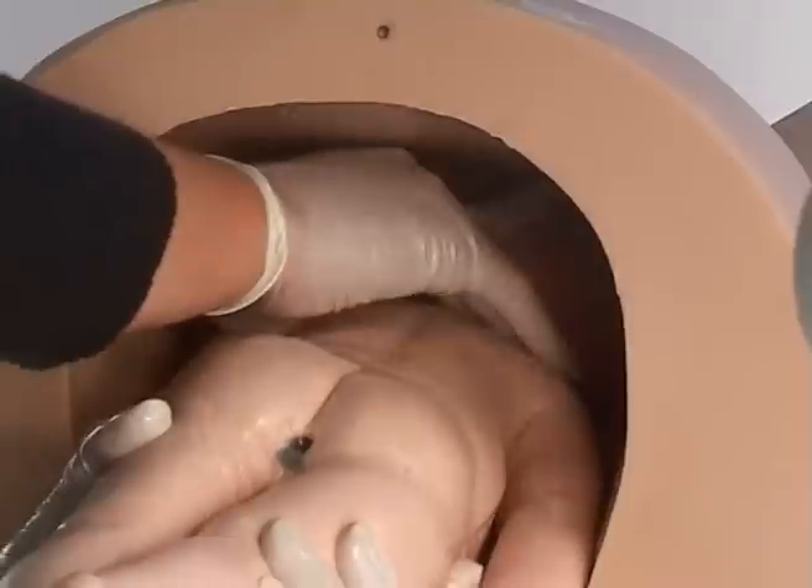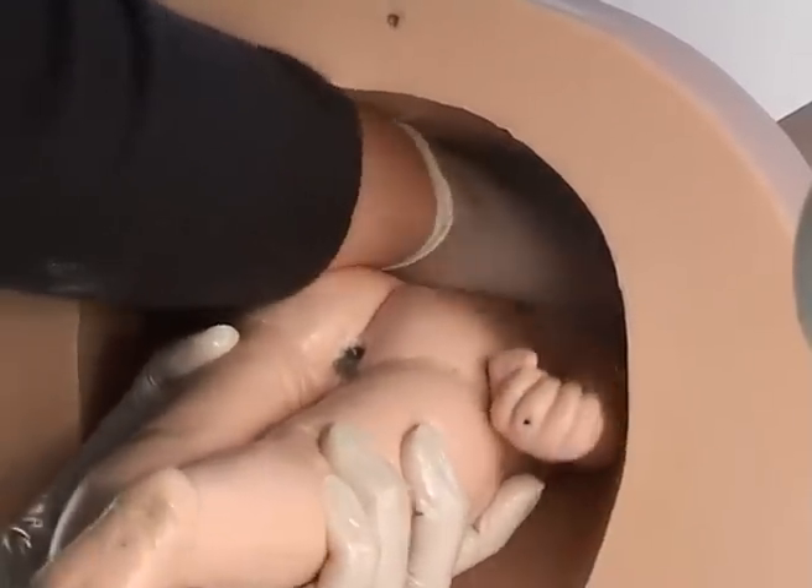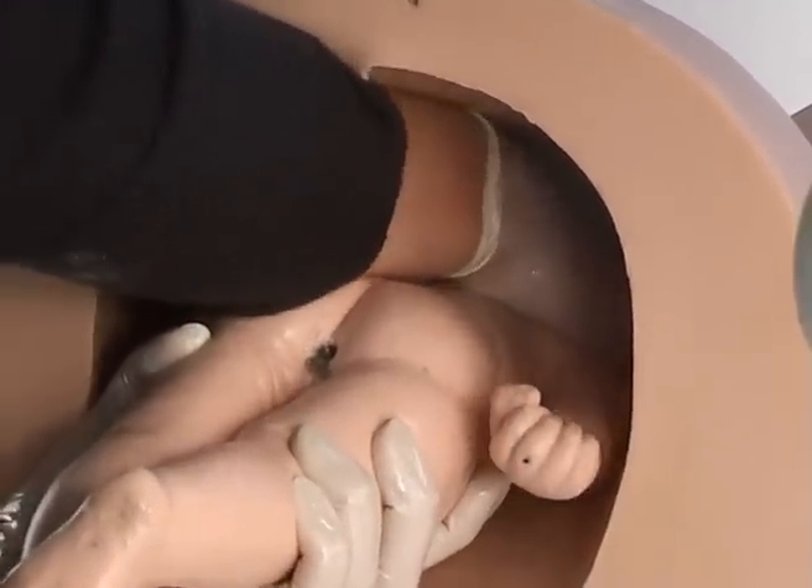Lie Sophie on her stomach and slide her head into the pelvic brim in the transverse position. Once inside the pelvis, put your hand beside her ear and swing the head to the midline.